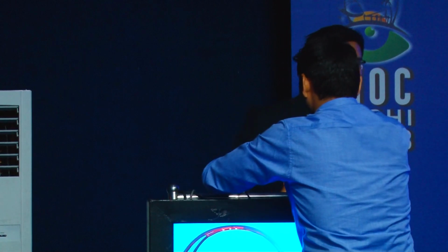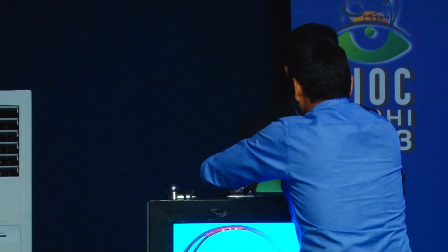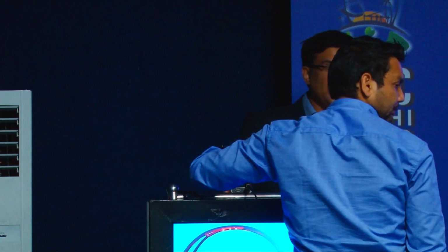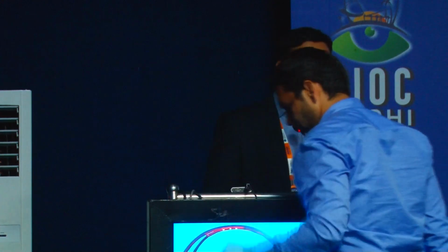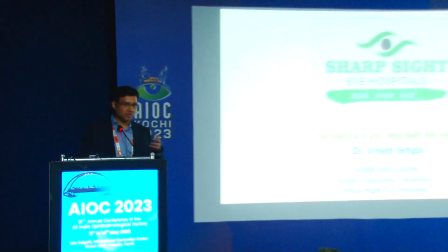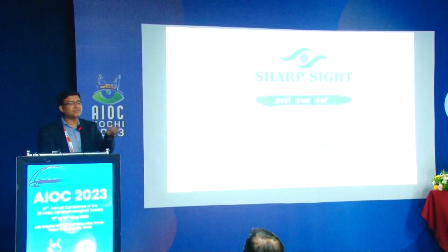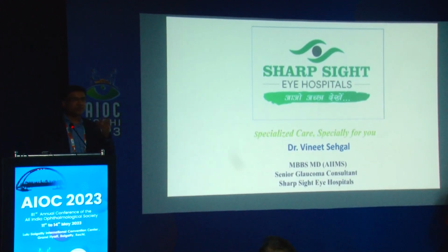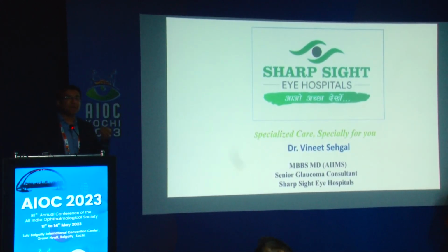The topic that I would be speaking about is micropulse laser and endocyclophotocoagulation as game changers. So actually, are these game changers, or are they just supplements, or the last thing that we can do? Most of these patients we are doing have already undergone TRAB, have already undergone GDD, post PK. In the COVID times, we are scared to go for surgeries. The patients were more scared to get the surgeries done. So in all these cases, I would say it's not actually a game changer. According to me, it is something which can just buy you time.